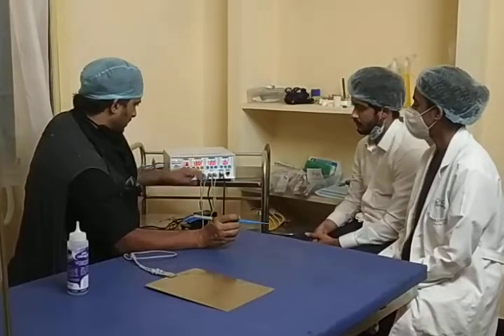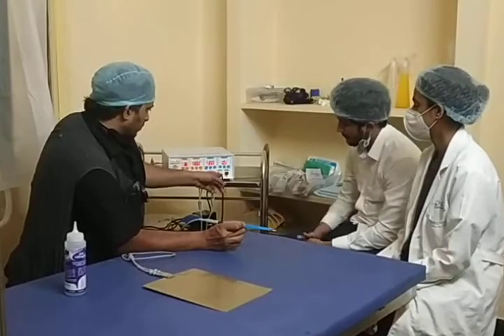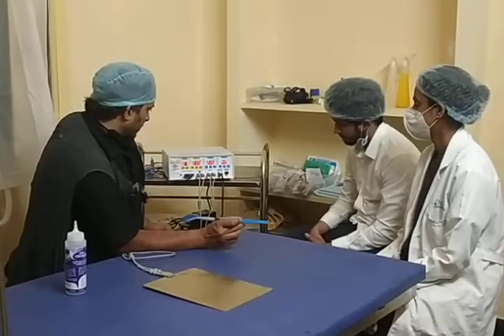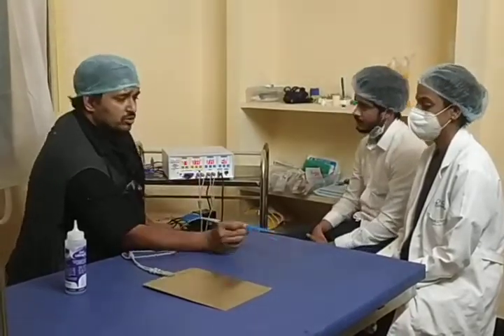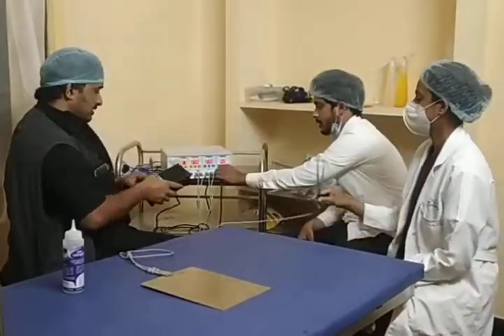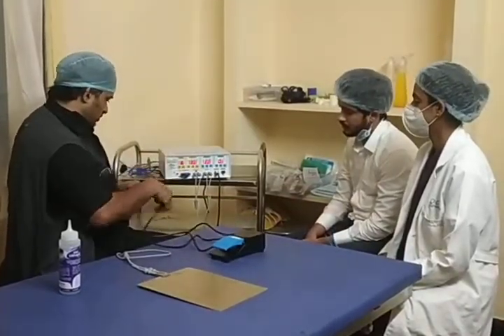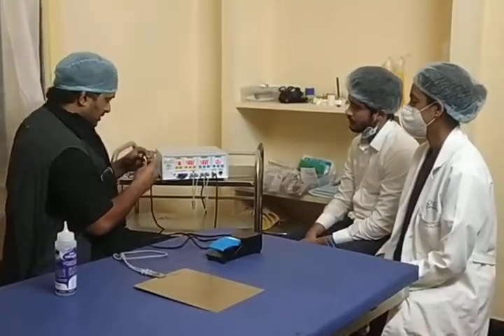So we need to go for a bipolar foot switch. This is a monopolar foot switch. Right now I need to have a bipolar foot switch for the bipolar option, because when I use this, I need the bipolar option. So this is the bipolar. It's a single plug over here. What I'm going to do is connect this again.